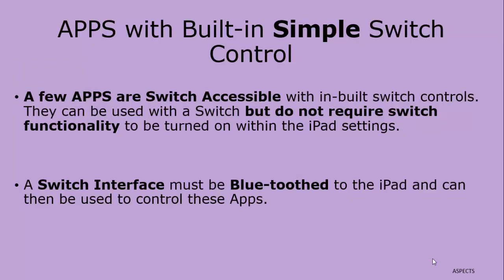Apps with built-in simple switch control. A few apps are switch accessible with built-in switch controls. They can be used with a switch but do not require switch functionality to be turned on within the iPad settings. A switch interface must be Bluetoothed to the iPad and can then be used to control these apps.